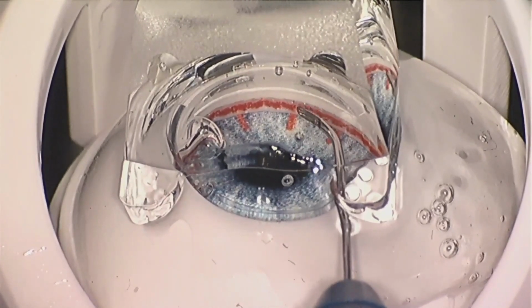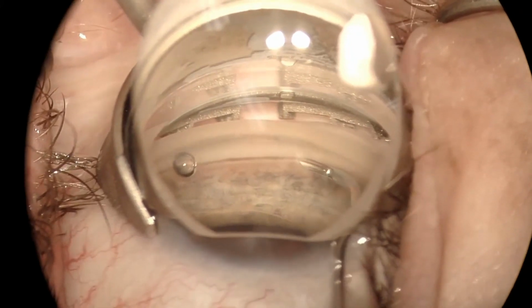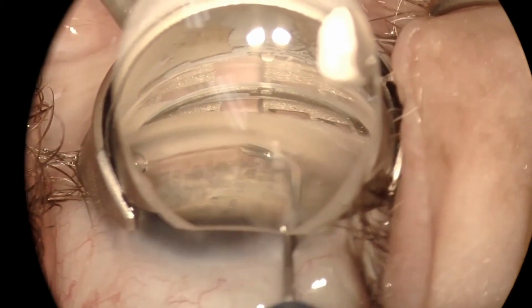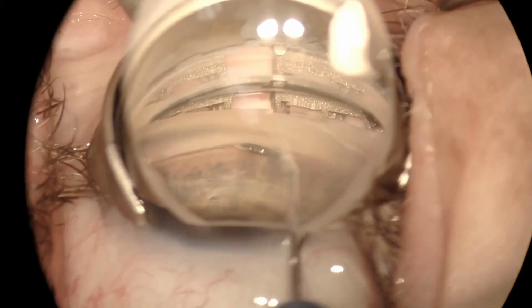And so now I've got the stent kind of reloaded. On this video, you can see I'm getting ready to deploy the stent. I've already entered the eye, and you do need a separate paracentesis with this procedure, just to allow for easier access to the eye. I made a secondary paracentesis just next to my main wound, and I'm getting ready to put the bevel into the trabecular meshwork.